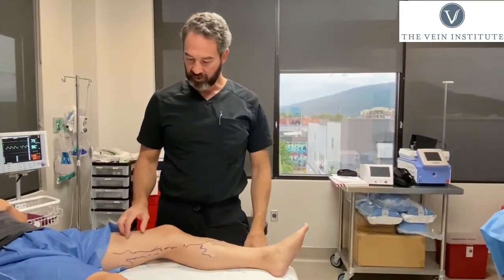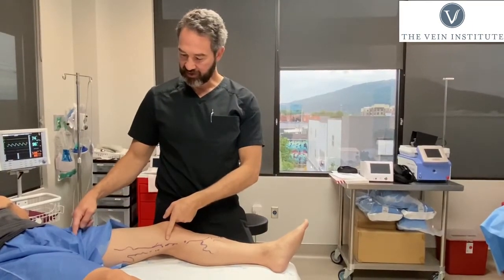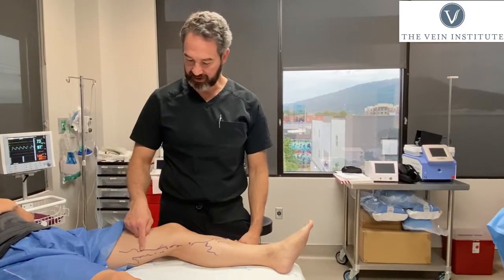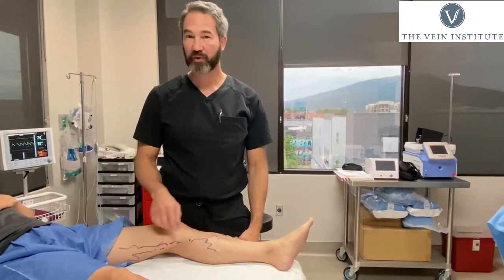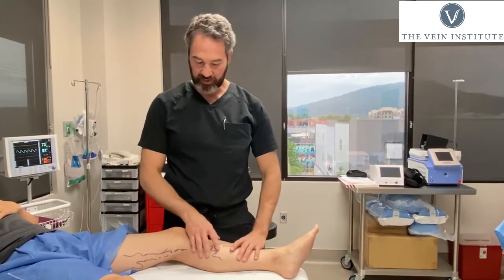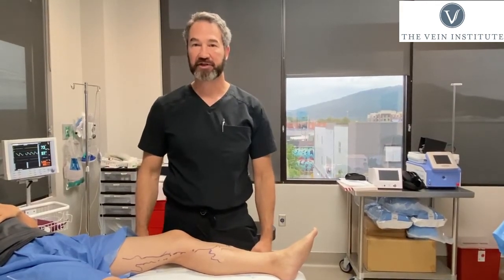We've got everything marked. We're going to do our procedure — we're going to thoroughly ablate the upper part of the vein. This is where it's literally stuck to the skin, and we don't want to burn that because we can burn the skin. So this part we're going to address with some microflabectomy techniques.